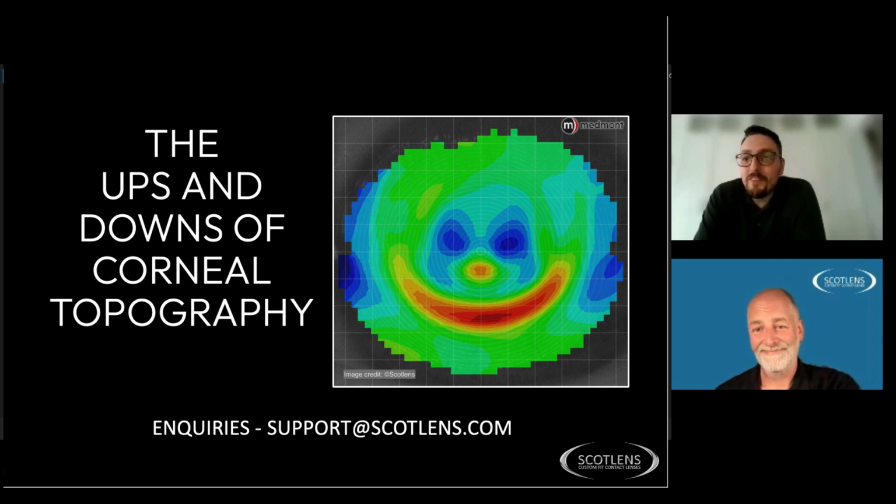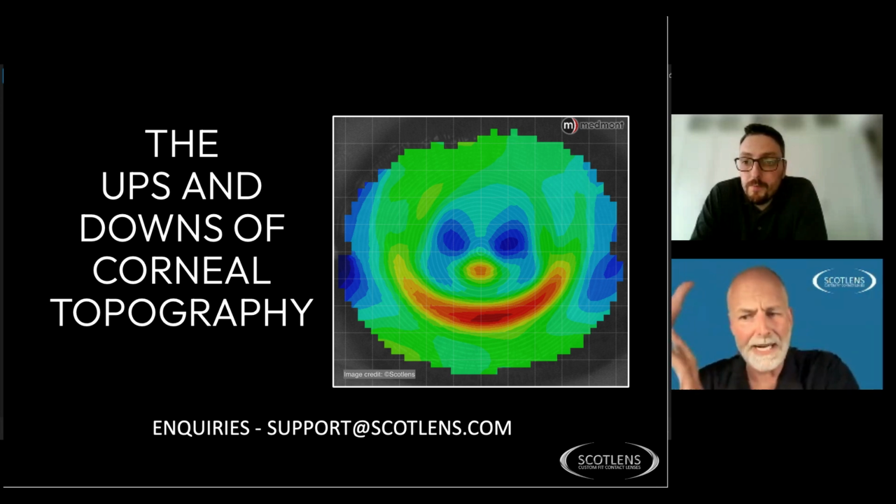So, if the cornea is stable at such a young age, would you consider fitting ortho-K to very young children? Yes. So, we need the myopia to kick in. And again, we need the myopia to be the vanilla myopes. So we don't want to be, for your 5-year-old patient that's already a -8, that's pathological myopia. We want to manage that pathology, not really be too concerned about the myopia control element of that.